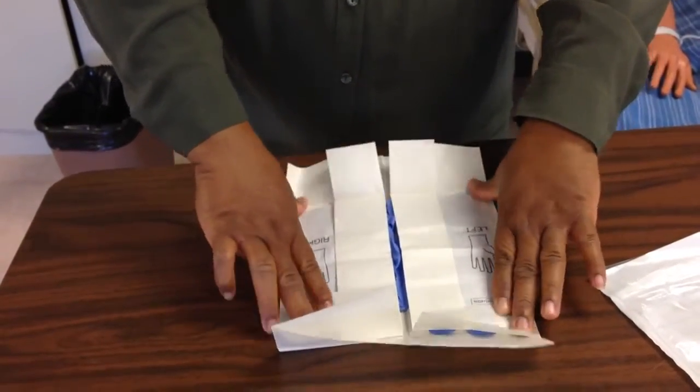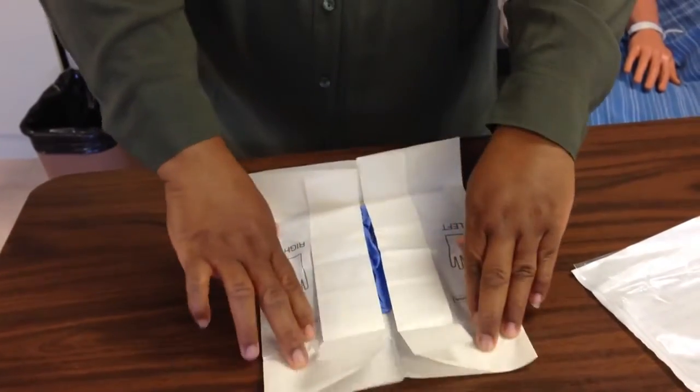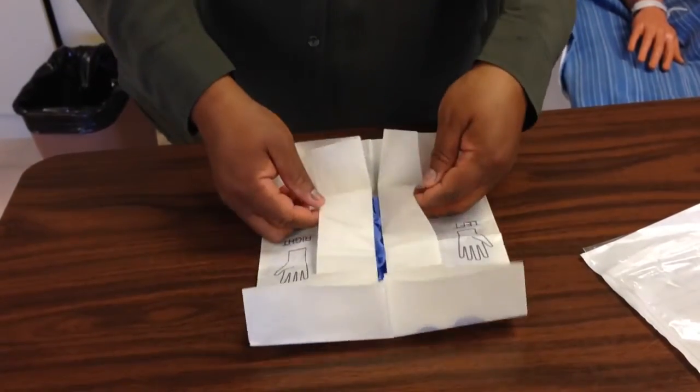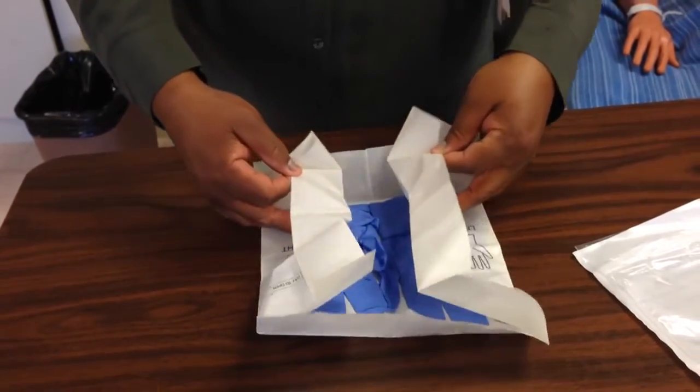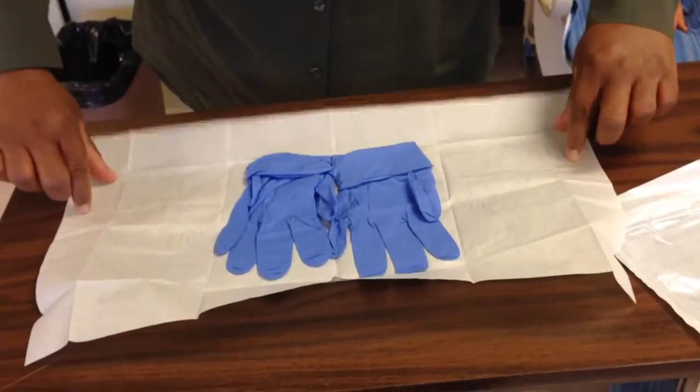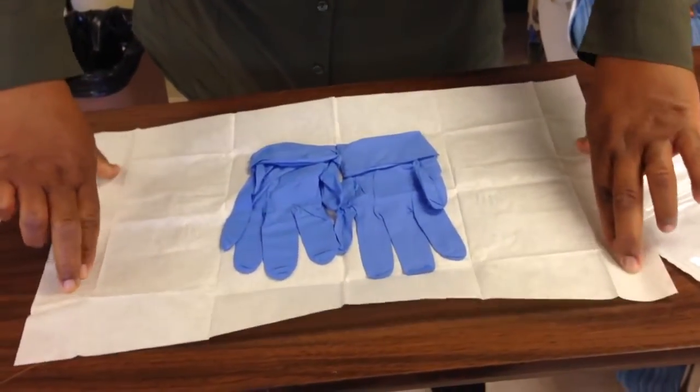I'm going to carefully open up the gloves as not to touch the gloves itself. I have the one inch border which I am going to touch to carefully open my gloves.